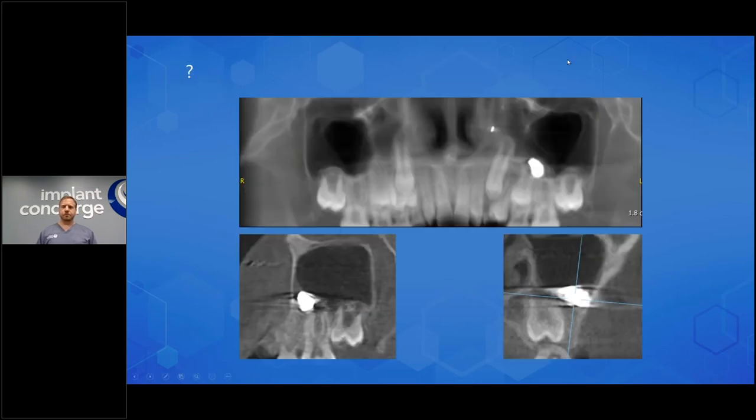We just had some questions wanting to clarify that previous patient. Was that just metal in the sinus from something going up the adolescent's nose, or is it pathology? It's too high density to be pathology. The patient was very young, and it was a shot. The other finding is the other high density you can see in the nasal cavity, which the patient somehow got up inside their nose. If they were shot, it's going to be a BB, because a shot to the face is probably going to do a little more damage than that. Also the cortical outline was continuous. I'm not saying that bone doesn't heal, it's possible, but there might be some other evidence.